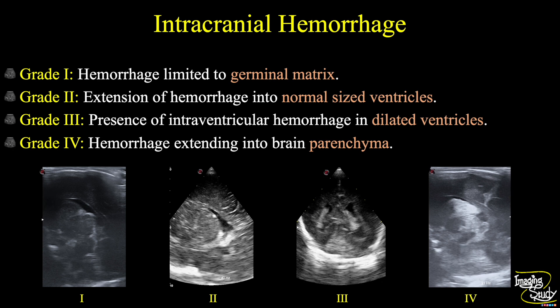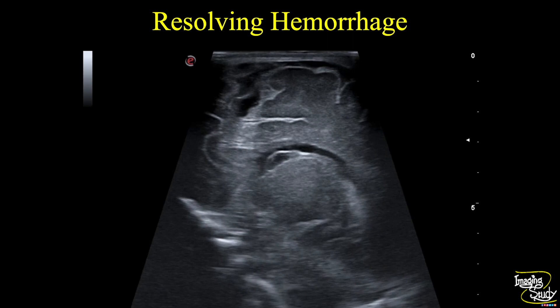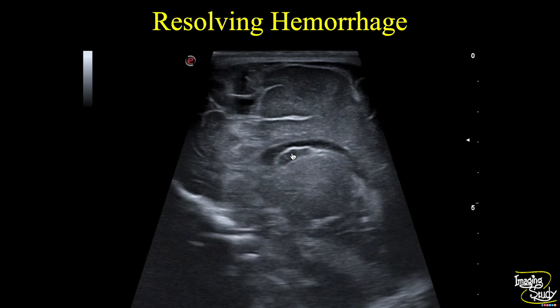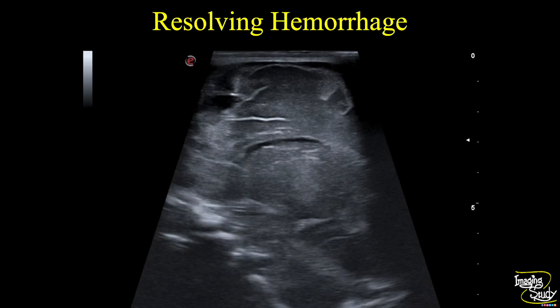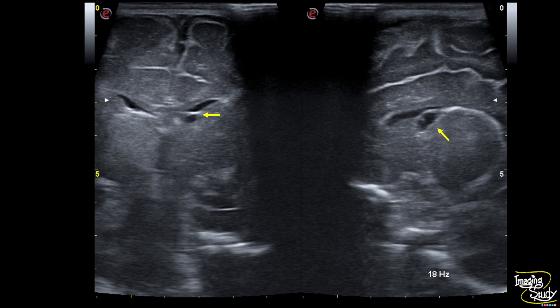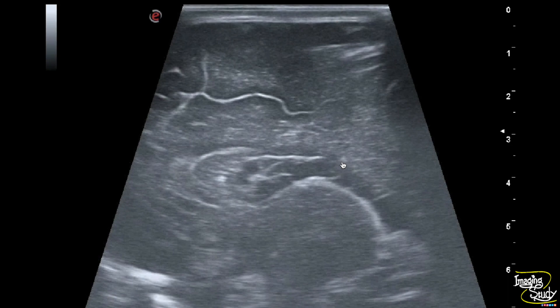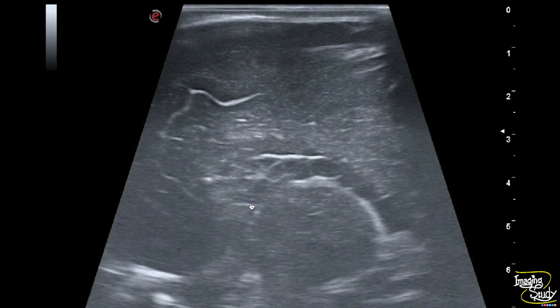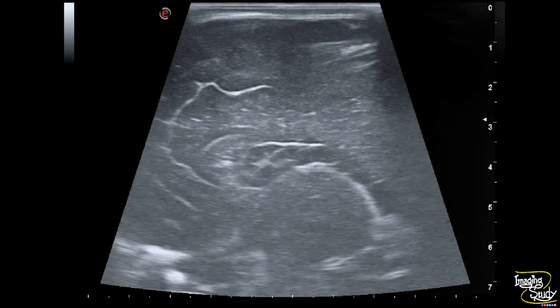To summarize the four grades: grade 1 hemorrhage is limited to the germinal matrix; grade 2 extends to normal-size ventricles; grade 3 shows dilated ventricles; and grade 4 has hemorrhage extending to the brain parenchyma. When these echogenic blood clots get resolved, here is a picture of a resolving hematoma — you see an anechoic cystic structure with a thick echogenic wall at the caudothalamic groove, slightly elongated unlike a choroid plexus cyst. Here is another case showing a multiseptate elongated cystic area at the caudothalamic groove extending to the lateral ventricle — this is the resolving hematoma of the patient previously shown as grade 2 intracranial hemorrhage.